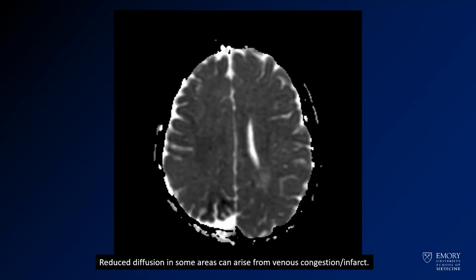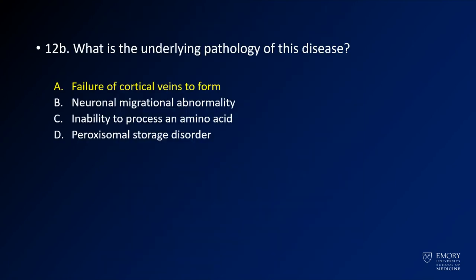Here on diffusion, you can get some areas of diffusion abnormality, which can be a sign of venous congestion and/or infarcts in those areas. As we mentioned, the underlying pathology of this disease is failure of cortical veins to form, which causes venous congestion — manifested by these abnormal medullary veins which we pointed out.